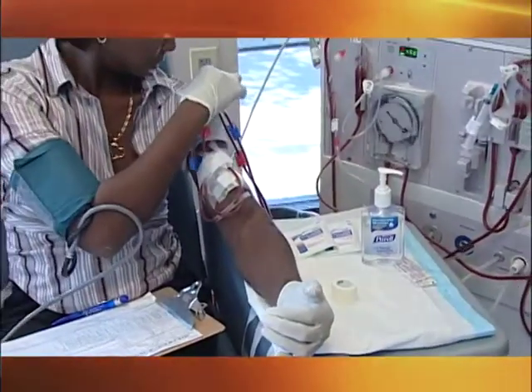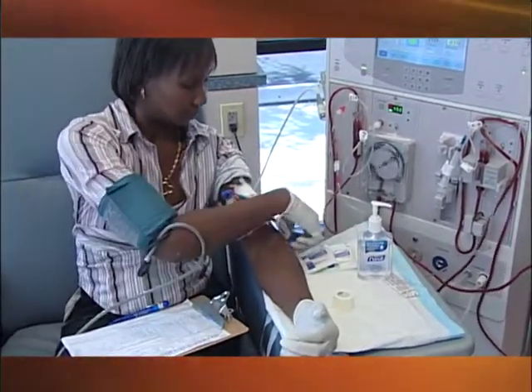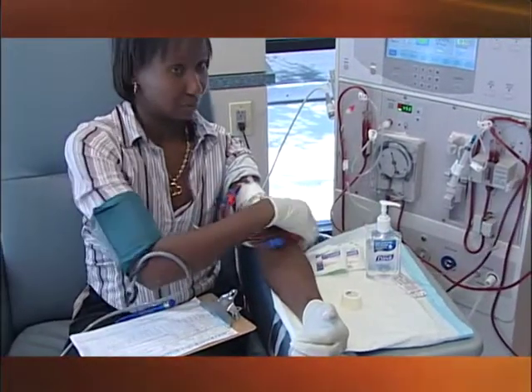A vascular access is needed in order for hemodialysis to be performed. Hemodialysis is a treatment where blood is removed from your body, run through a dialysis machine, and then returned to your body.